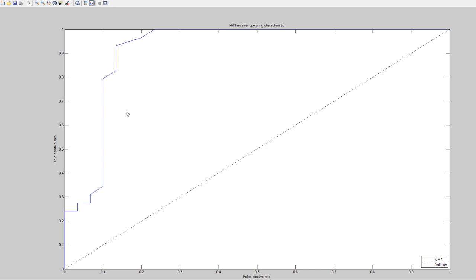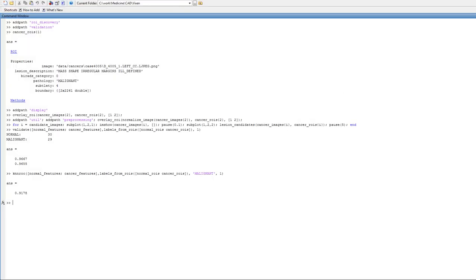So this is actually excellent. Radiologists do like that sort of curve. Our performance is very good. We're identifying almost all of the cancers in the data set. We're not identifying very many false positives. The area under this curve, which is commonly used as a measure of performance, is over 91%. So that is excellent. You can't get a classifier that does that well very easily. It took a lot of time, a lot of research to be able to do this.